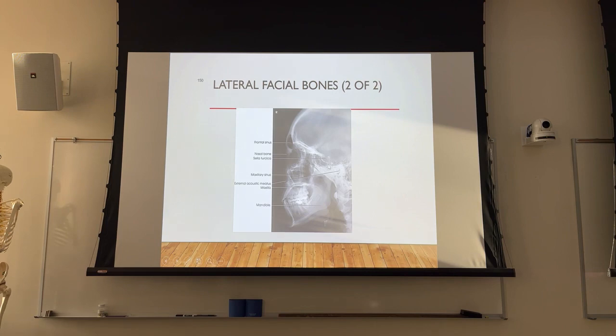So it looks like that. We see sella turcica, we see the orbits. They included the entire mandible. Certainly you would not go back and reshoot that to collimate the mandible off, right? But you see all the facial bones. Notice what you don't see well are the nasal bones, right? So the nasal bones, for the most part, we're going to shoot separate.